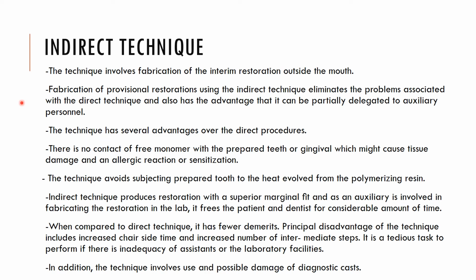The indirect technique produces a restoration with a superior marginal fit, and an auxiliary can be involved in fabricating the restoration in the lab, so it frees the patient's and the dentist's time.